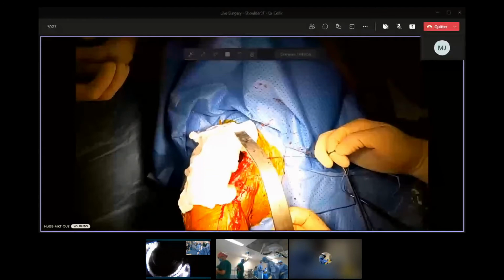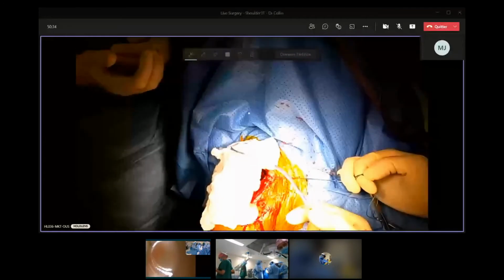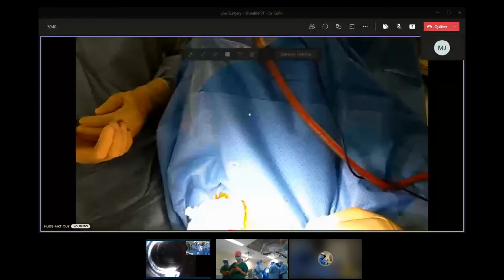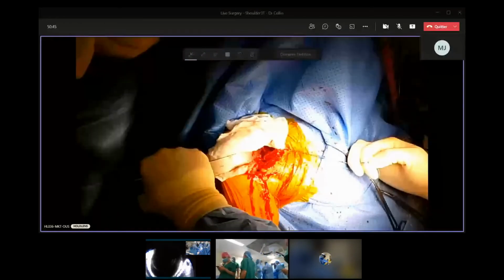The key point of the glenoidal exposure is the retractor. You need a straight one like this, okay? So you need to put it here and put the head not inferiorly, but put the head posteriorly like this.